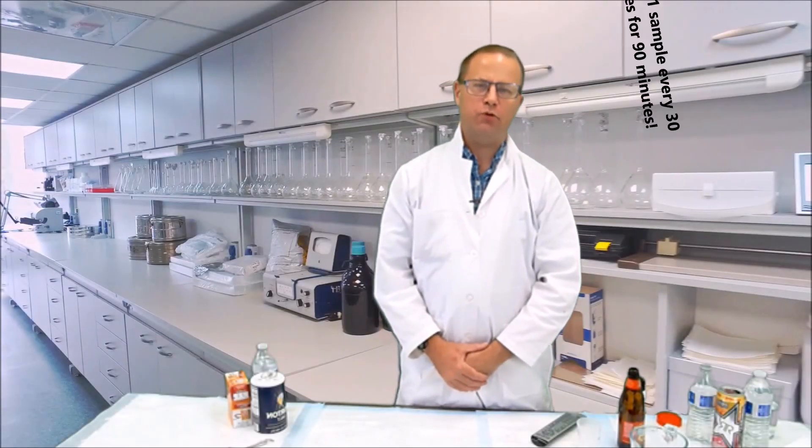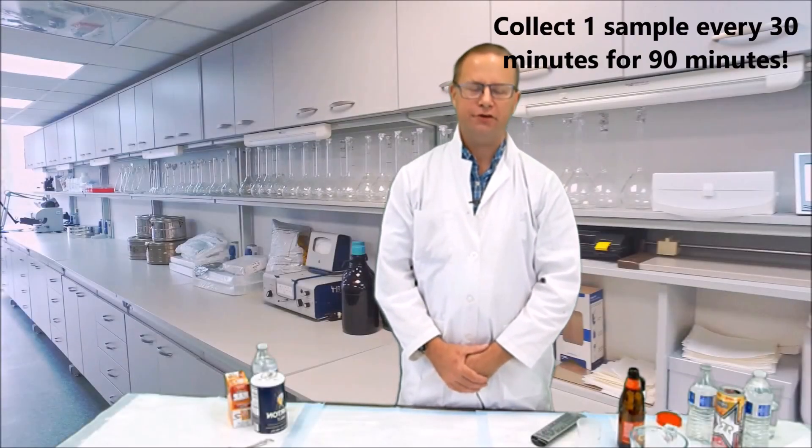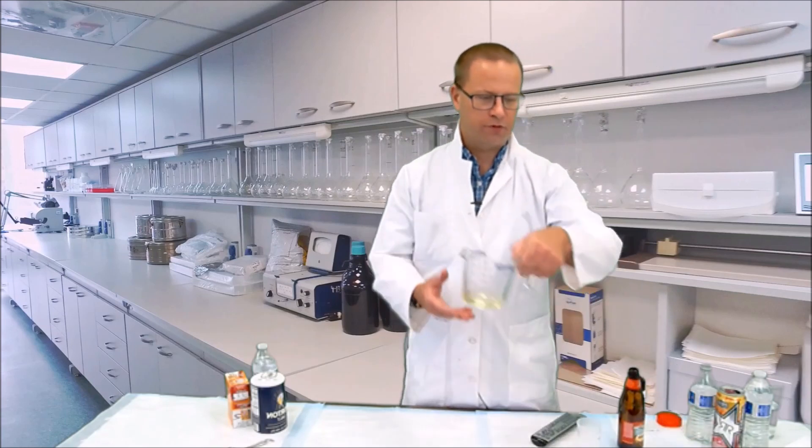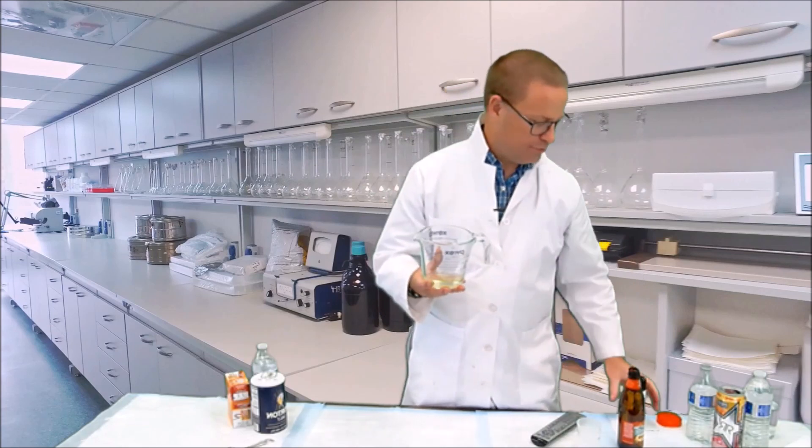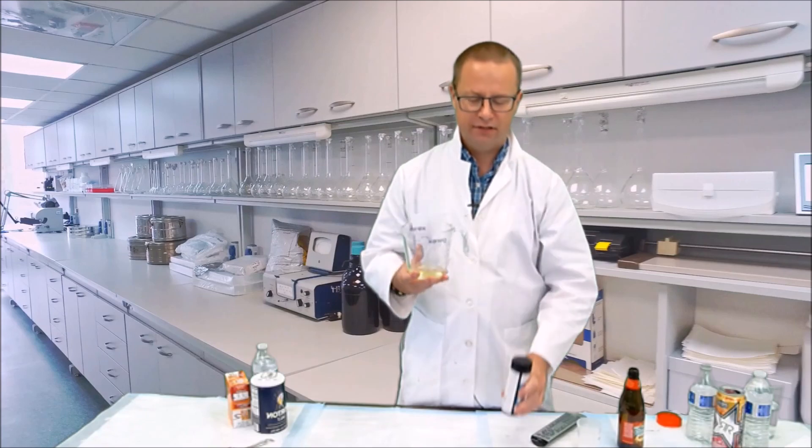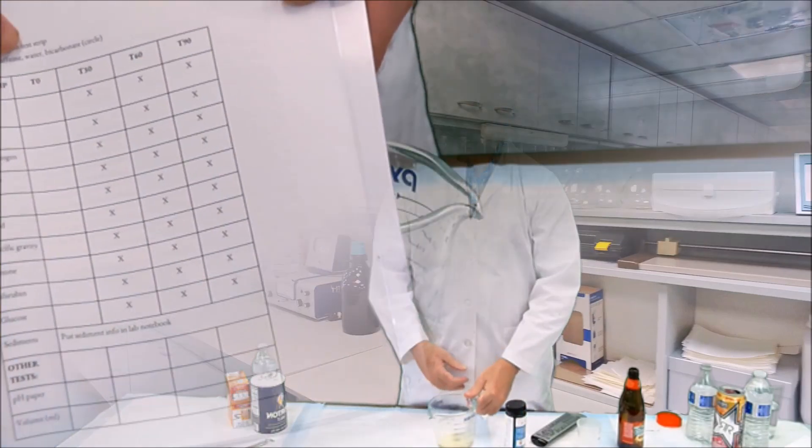After collecting your second sample, you want to wait 30 more minutes before collecting your third sample. So this should be taken about an hour after you started the exercise. Again, you're going to record your urine volume. Use your urinalysis test strips to determine the chemistry, specific gravity, and pH. And then you're going to set a timer for another 30 minutes.